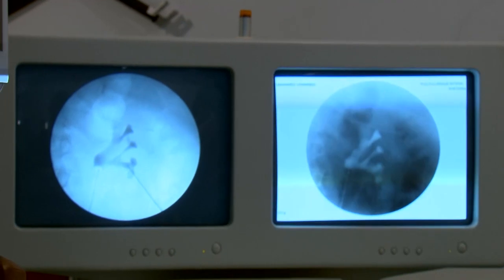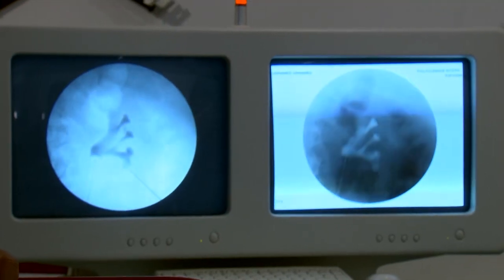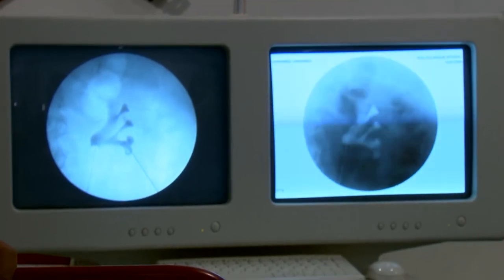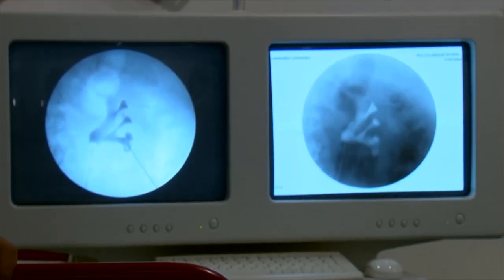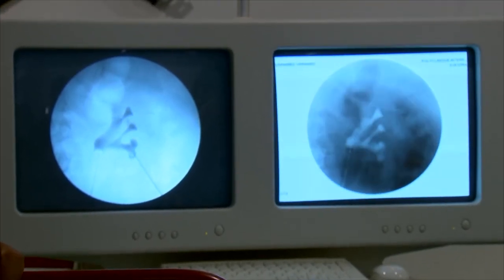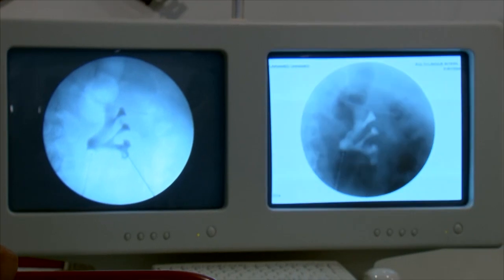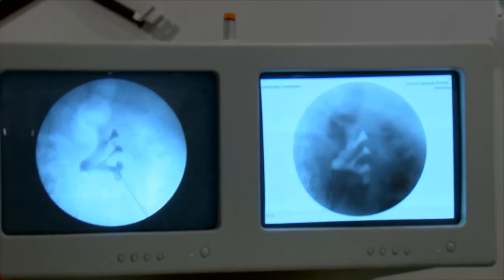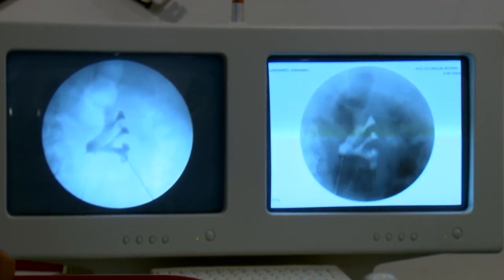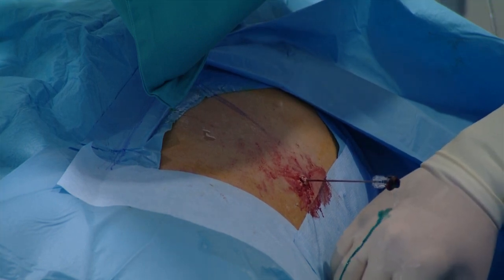X-ray? Or continuous? Wait, yes, we see that the calyx is moving. Yes, good. Syringe. We are just next to our stone, I'm sure. Okay, it is black in there, no? Let's have a look here. Show us the external view. It's good, yes. You are satisfied? Blue in the middle, it's fine.